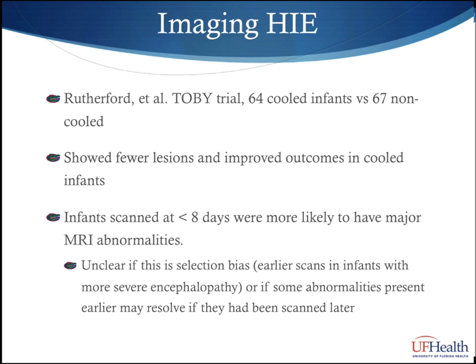One of the studies I would like to specifically mention is the study by Rutherford, which was composed of imaging data from the TOBY trial. One of the things that they found was that there seemed to be fewer lesions and improved outcomes in cooled infants versus the non-cooled controls. While their scan data consisted of imaging anywhere from 6 to 11 days, a sub-analysis of the data shows that infants scanned at less than 8 days were more likely to have major MRI abnormalities.